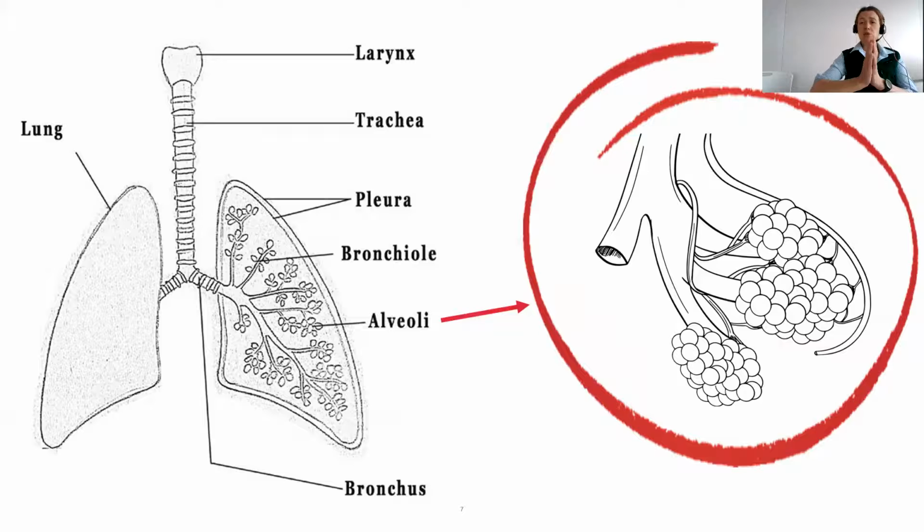As we breathe in, normally alveoli open like a balloon, and then as we breathe out, they close down. When we apply PEEP, or a positive end expiratory pressure, we breathe in and the alveoli open, and as we breathe out, because there's a positive pressure, the alveoli don't close all the way down, they actually remain splinted open. So useful for continuing to exchange oxygen and useful for pushing fluid back into the circulatory system.